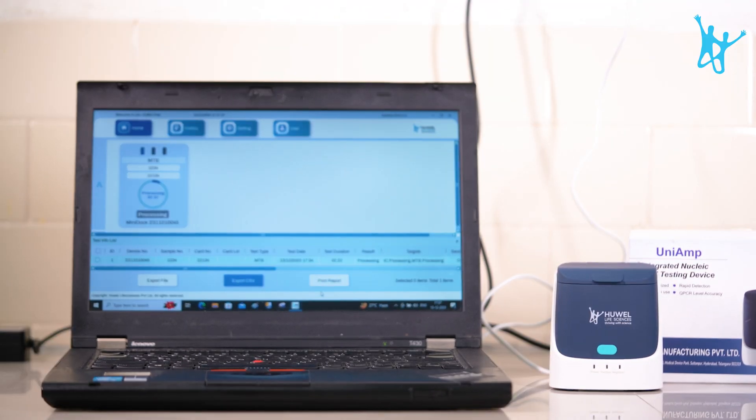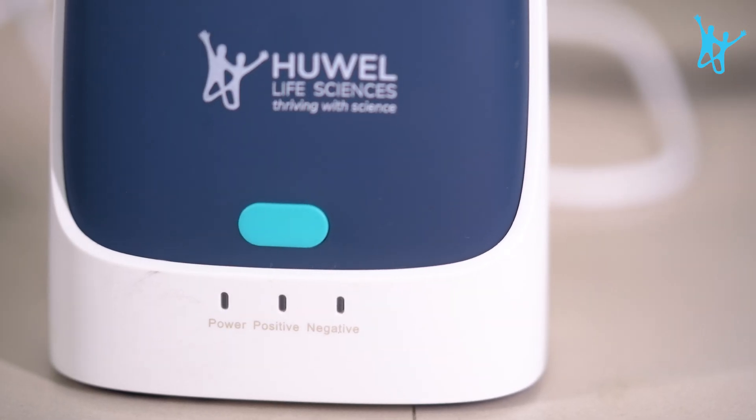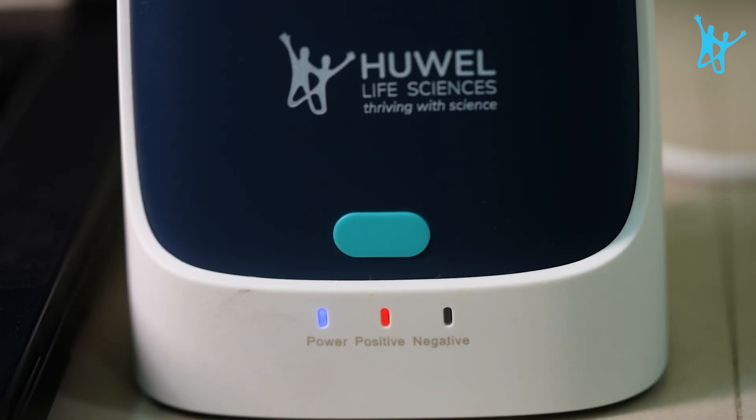One of its true kind, UNI-AMP is embedded with isothermal amplification with a novel probe reporter system for detection, which makes the results super specific. On top of that, multiple infections can be detected in the same cartridge.